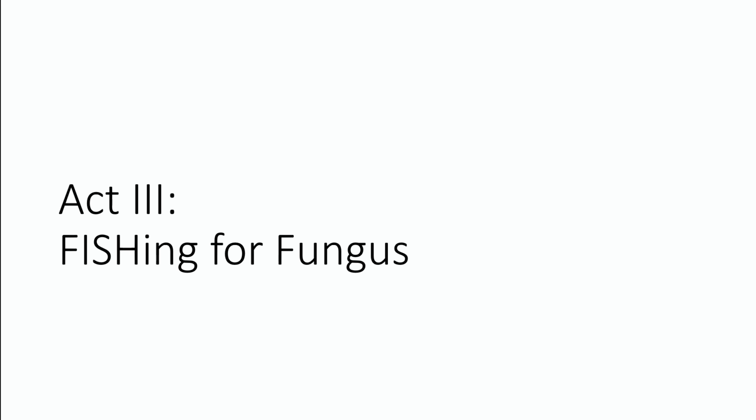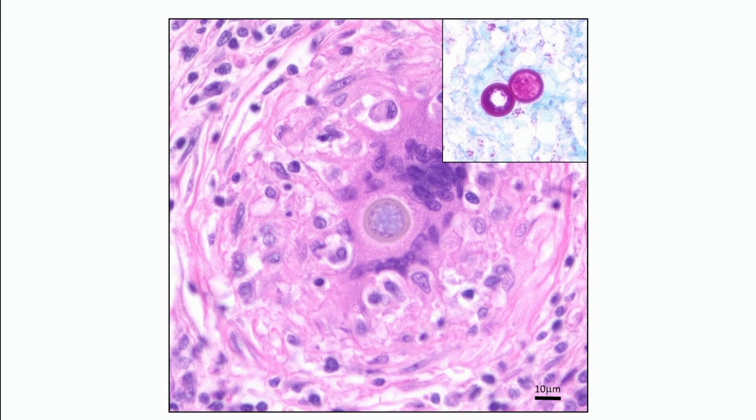So I want to move on to the last vignette that I have in the last few minutes, which is what happens when I don't get a PCR result, there's fungus in tissue, and I want to try and make a diagnosis. And so I'll start again with this one case, which was shared by me with my colleague and teacher, Larry True. And for those of you who trained with me, you might be wondering what on earth this is doing in a prostate. This was a cystoprostatectomy from a 62-year-old guy with a high-grade urothelial neoplasia.